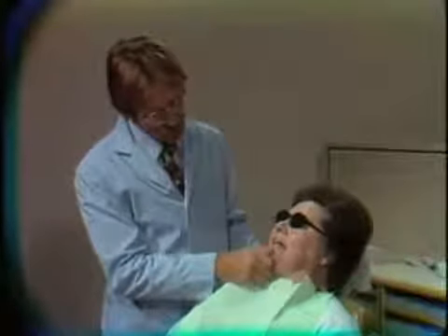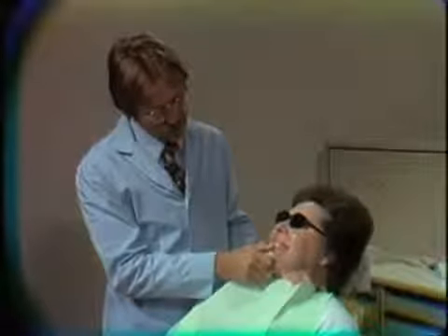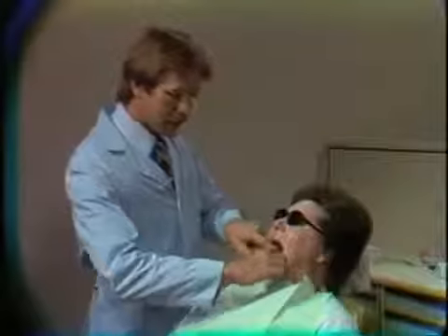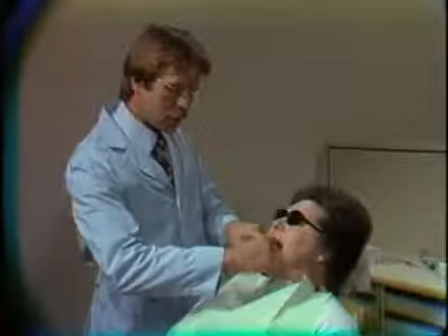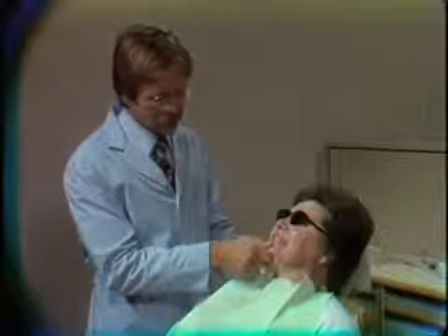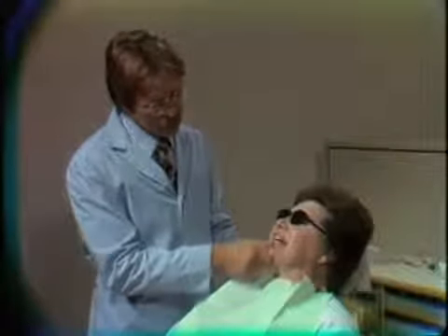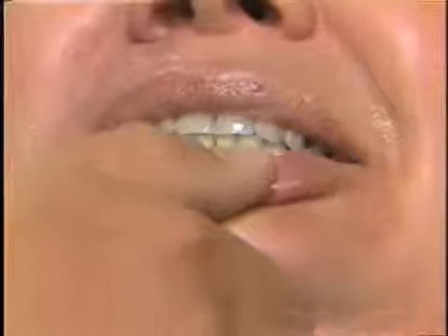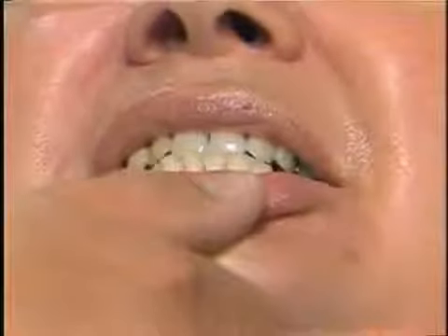Close that together. That's it. Just tap. Okay, open. Feel it, just not quite seated. Tap together. Okay, now just move from side to side. Does that interfere any place? No? Straight forward, bite together, and move straight forward. That's right. Just move around all different possible excursions. Just rub your teeth. And that doesn't interfere in any way.